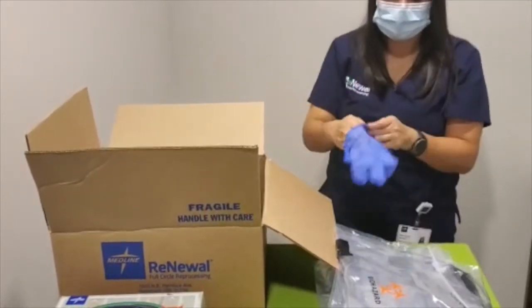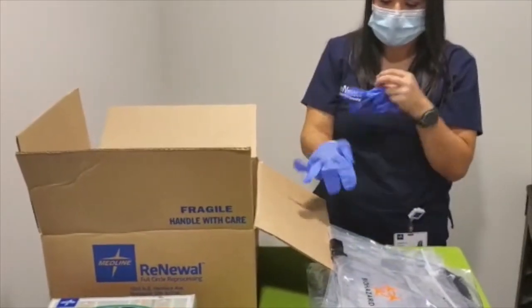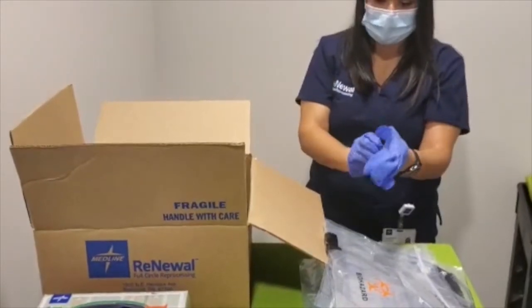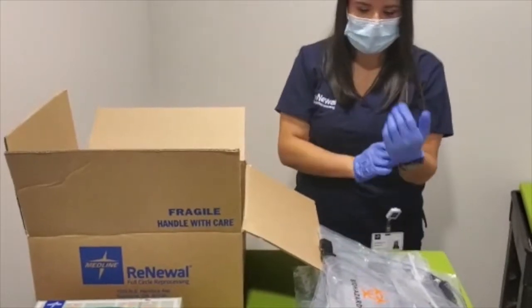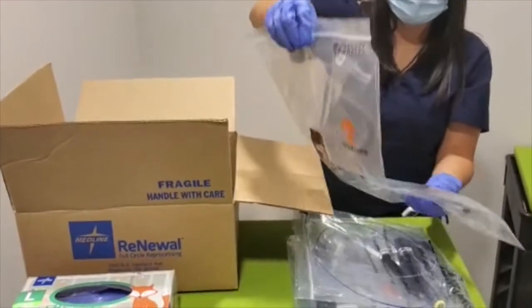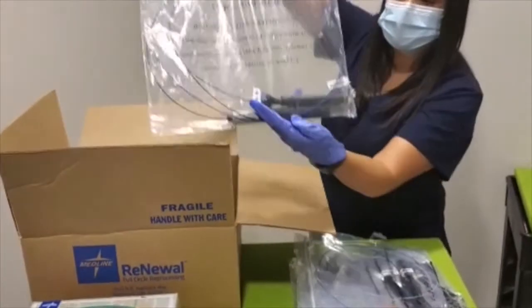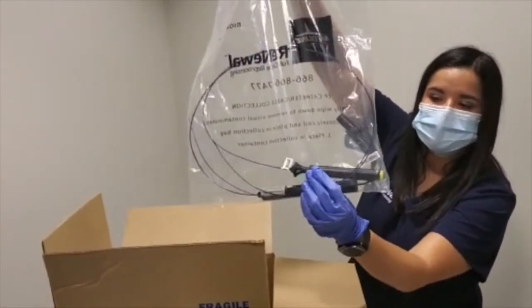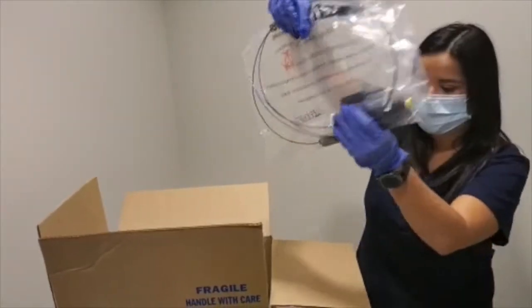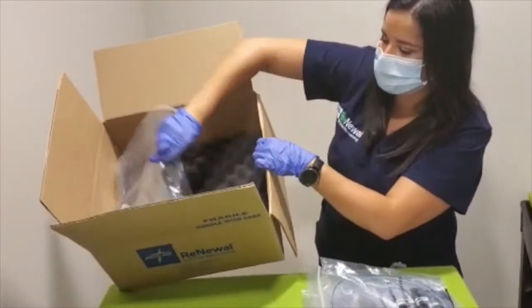As you place your EP catheters into your box, you want to make sure you keep a tally of what you're collecting and differentiate the two types of catheters you might be collecting. Those with a bigger handle will be considered your steerable catheters. Go ahead and place them in your bag and in your box.